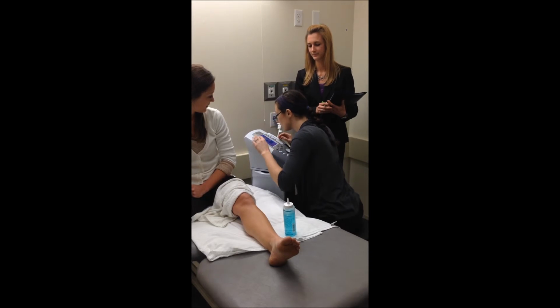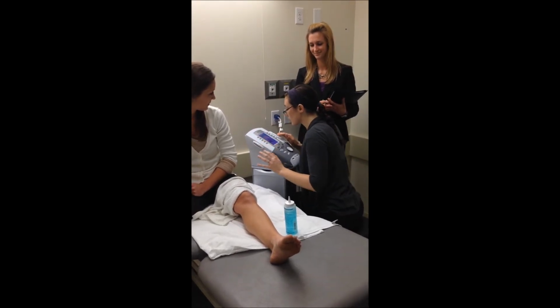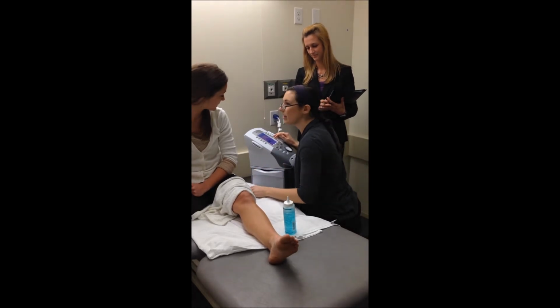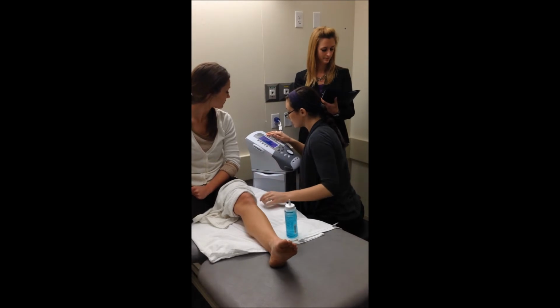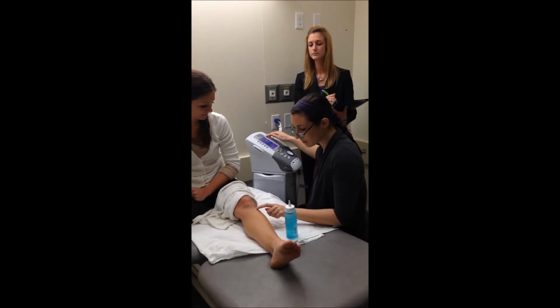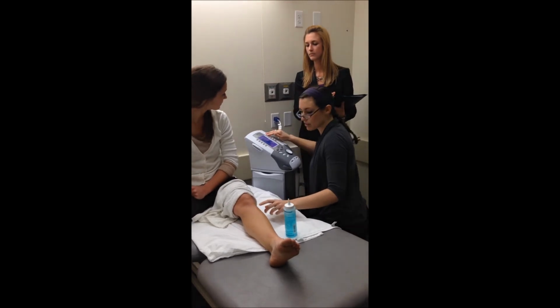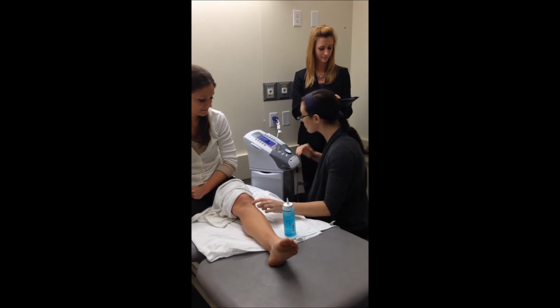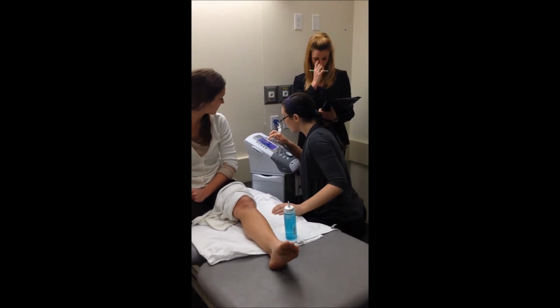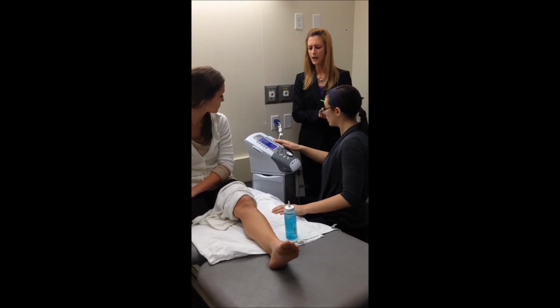Okay. I think we're doing ultrasound here. Edit. And we're going to be doing this here, patella tendon. And I'm going to do 3 because I think it's pretty superficial. Very good. And what else do you want from me? How about the intensity?